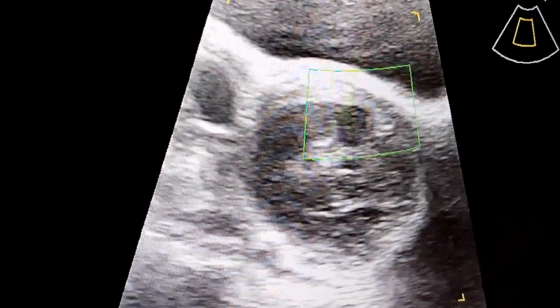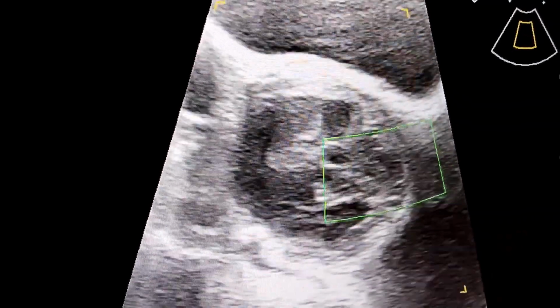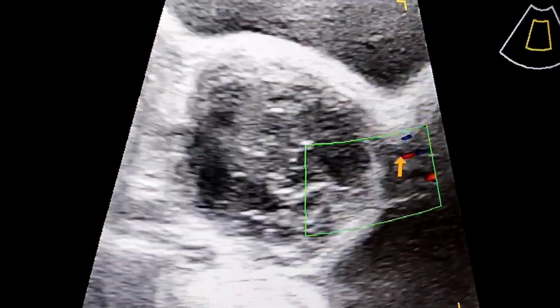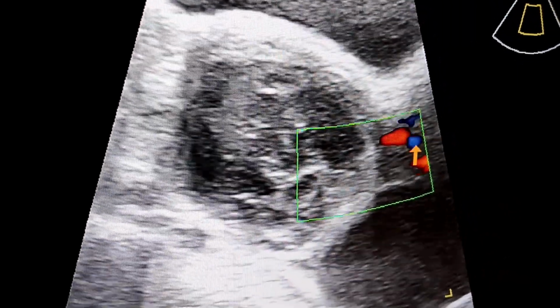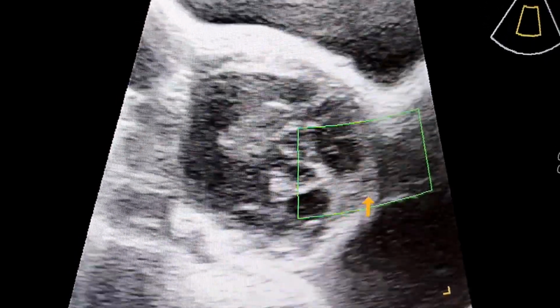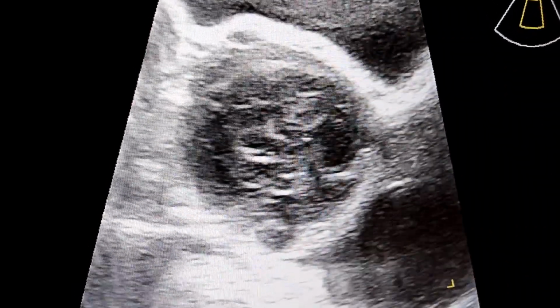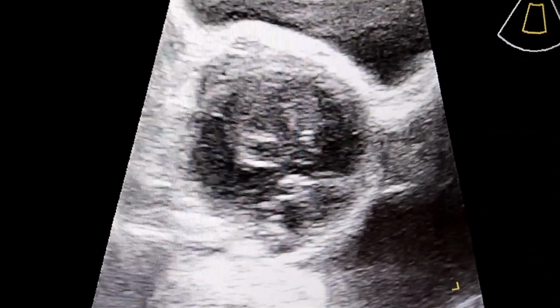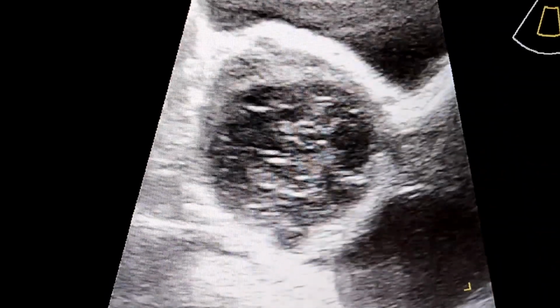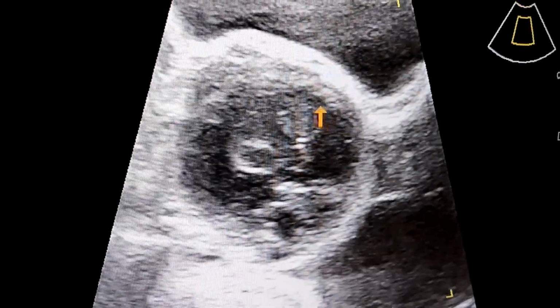So I am going to see the vascularity. Here we can appreciate the vascularity, but when we closely observe, this is outside the wall of this cystic lesion. So whenever we are going to examine a lesion such as this one, we should always magnify the image, zoom it so that we can have better visualization. So this is the cystic lesion.